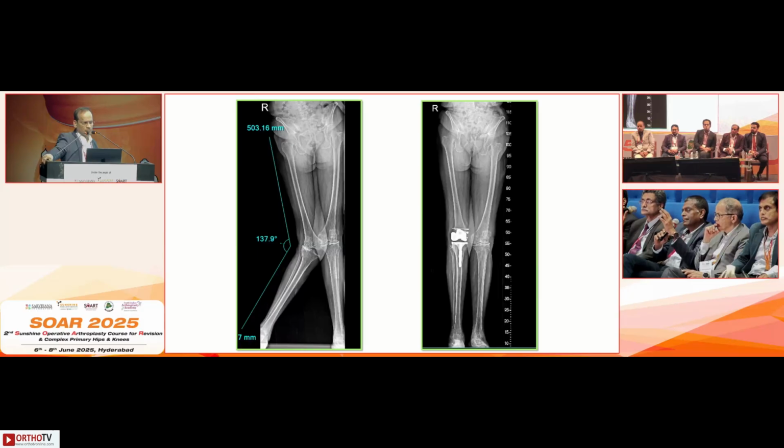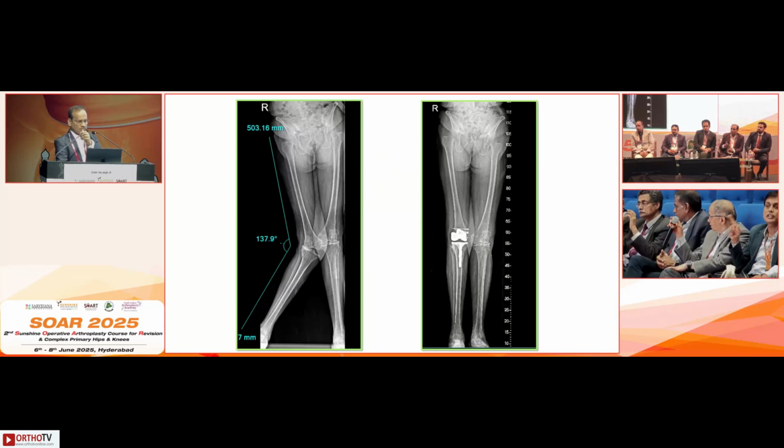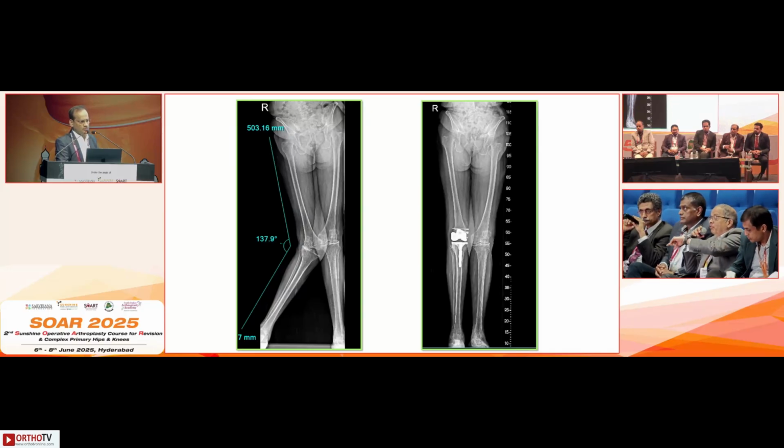The lateral side epicondylar osteotomy works well because there are a lot of other structures as well, and LCL is one of the structures. So we are okay with that, but not with the MCL, which is the only structure on which the entire biomechanics is hinging on. It also puts a stress on the mid-flexion stability. And 1 centimeter migration in flexion, imagine what is happening to that 1 centimeter proximal migration in 90 degrees flexion. That's what I said. Where is that medial collateral going? In the flexion, significantly, the center of rotation is getting shifted.